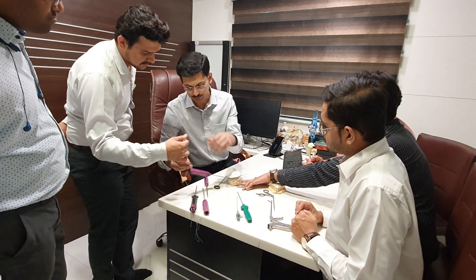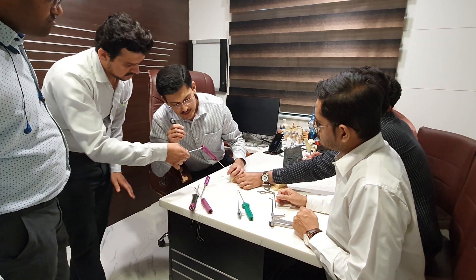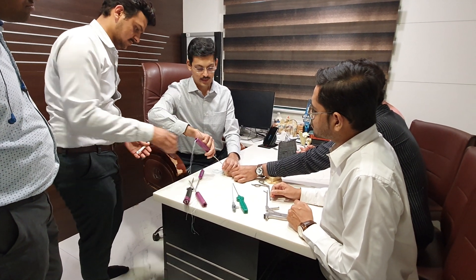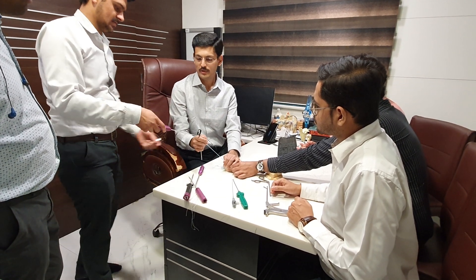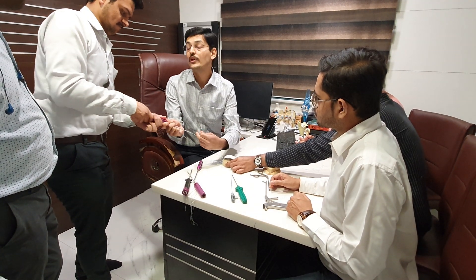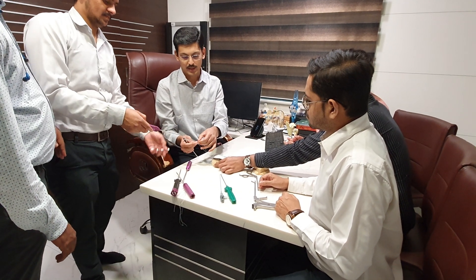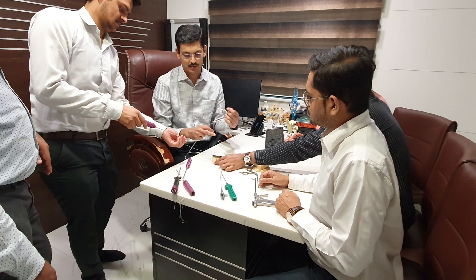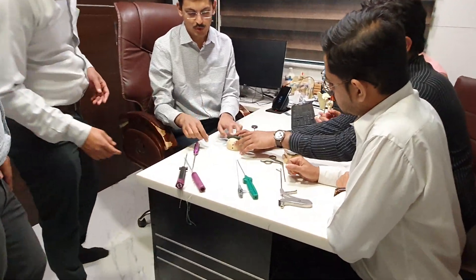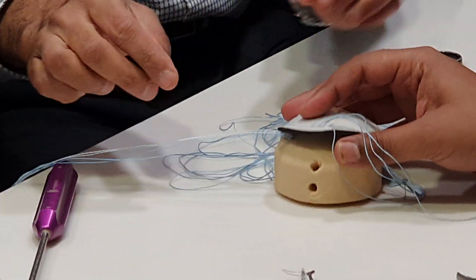You can use an artery to pull this anchor out. There is a paper you need to pull out, and then just take it out. Now we have a medial row anchor inserted. As mentioned, this comes in different designs. This particular anchor uses sliding knots — both threads are sliding. We will now show different types of knots.